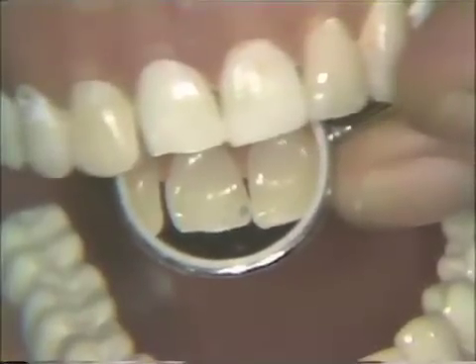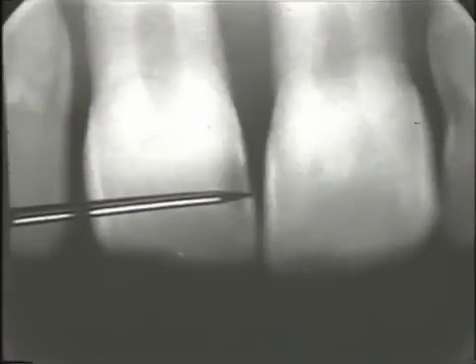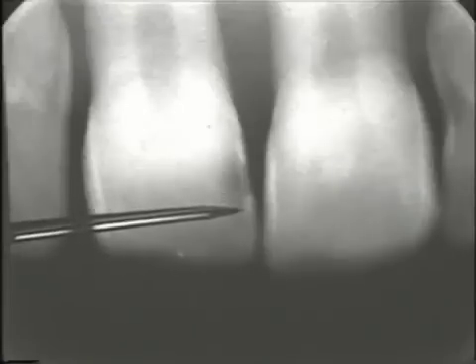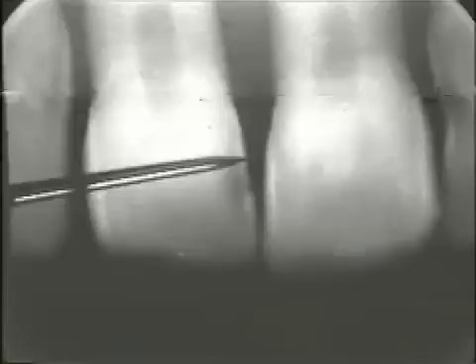The next step then will be to look at the x-ray again to see just how large this lesion is. If you notice the extent here as we come in, the dento-enamel junction is broken. We go down incisally, now axially toward the pulp, and notice as it goes to the cervical and then back up through the dento-enamel junction.